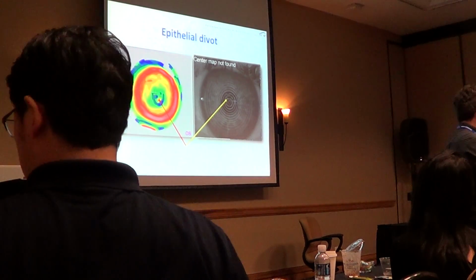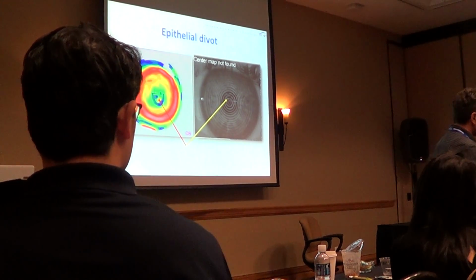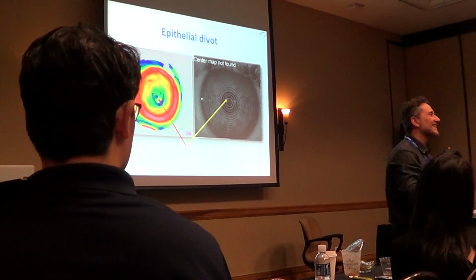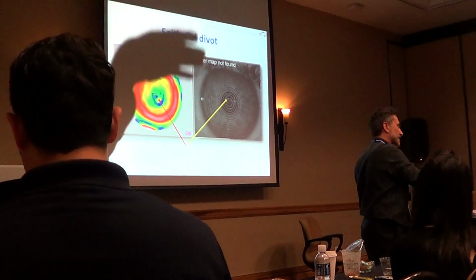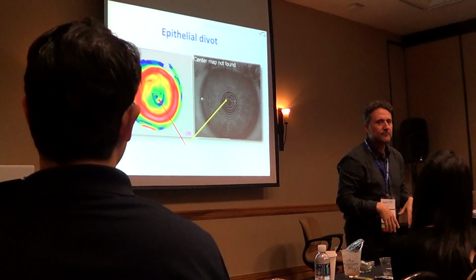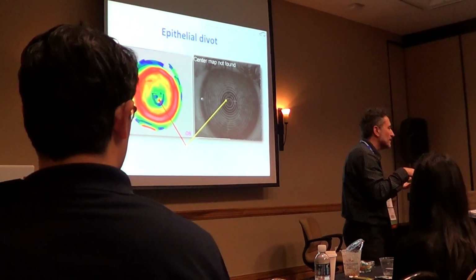All of us are trying things. In the past I worked by trial sets. Then I moved to empirical, and then I moved to trial set plus empirical. So at this moment I am again in the trial set plus empirical. I calculate the lens using the topography data and so on. I choose from my trial set the closest lens. I place it on the eye with the fluorescein in, always from down to up, to avoid bubbles.